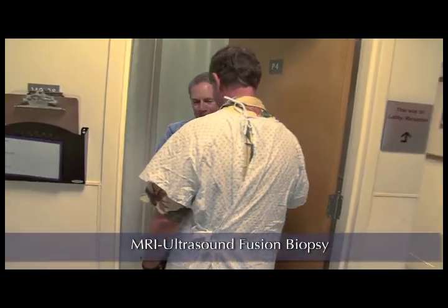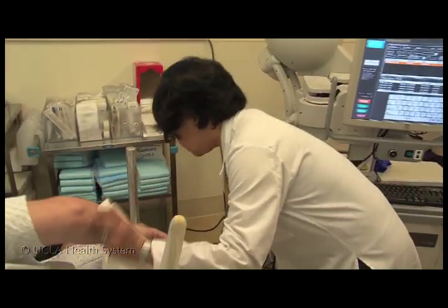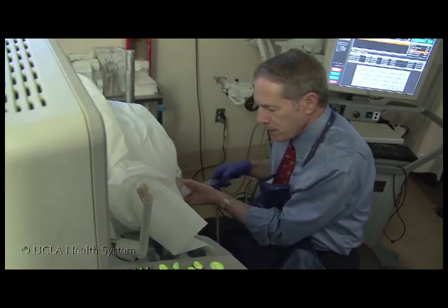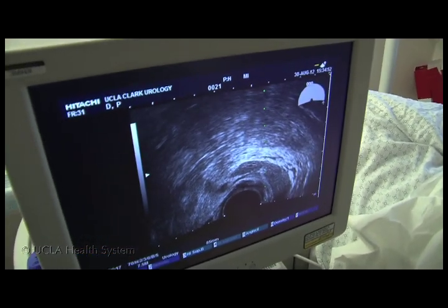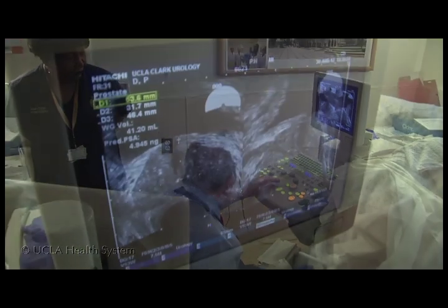The procedure we are performing involves MRI ultrasound fusion to perform targeted prostate biopsy. The patient is positioned in the left lateral decubitus position, just as for a conventional prostate biopsy. First, a regional prostatic block is performed by infiltrating 1% plain xylocaine at the base of the prostate dorsolaterally, tracking the neurovascular bundles. Next, the geometric volume of the prostate is calculated, 41.2 cc's for this prostate.